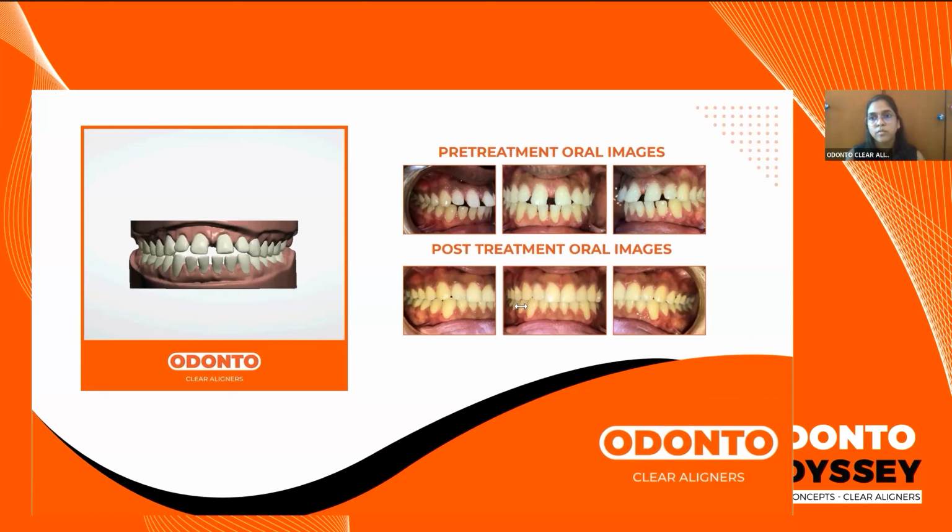Because if you go in for any topical fluoride application which takes up space, it has bulk to it, then once you apply that, it negates the amount of proximal reduction which you have done to a certain extent. So you might have done 0.3, but if your fluoride application is slightly thicker and doesn't get removed completely, then you're occupying the space of proximal reduction that you have performed. Polishing after proximal stripping, yes.